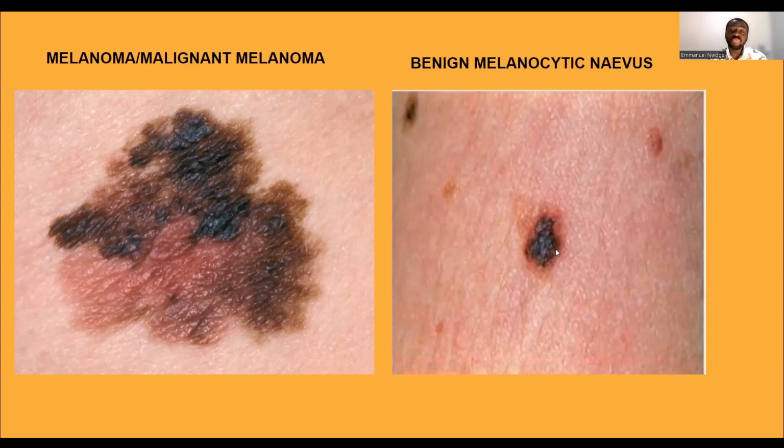But when you apply a dermoscope onto this lesion, if it's a benign melanocytic nevus, at that point you begin to see a uniform pattern of pigmentary distribution, a uniform network. That is what we usually take to mean this is a benign lesion, and a non-uniform or random pigmentary network, we usually say that this is highly suspicious of a malignant melanoma.